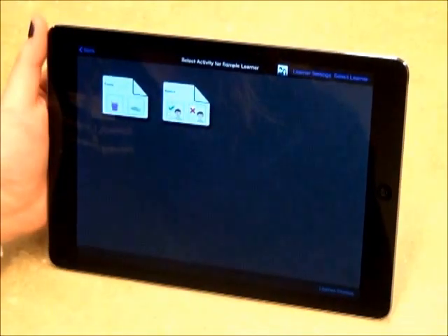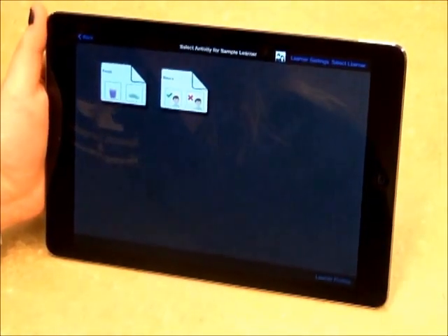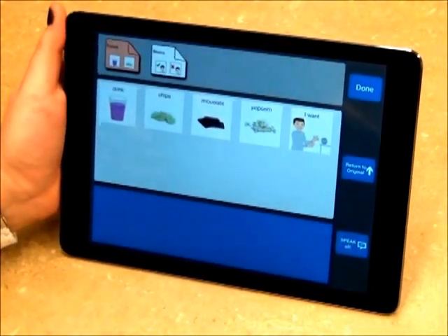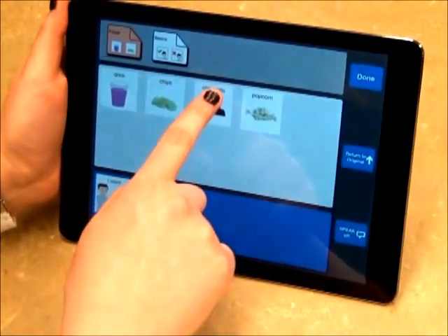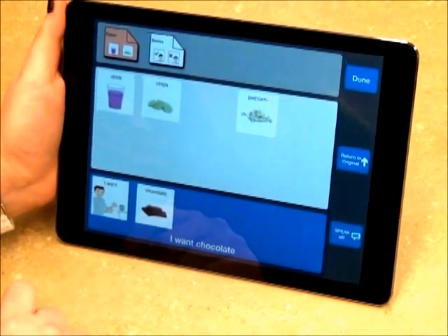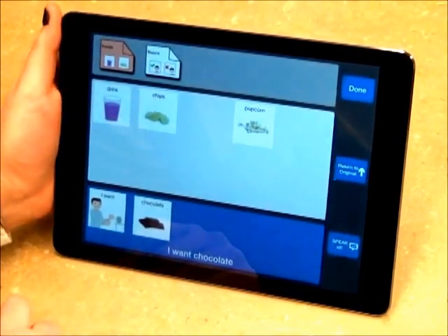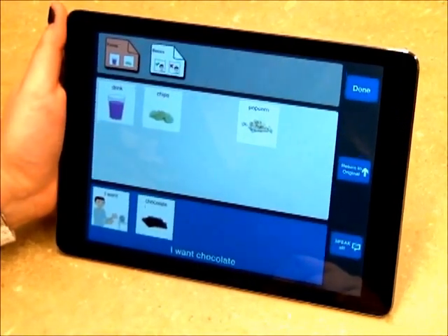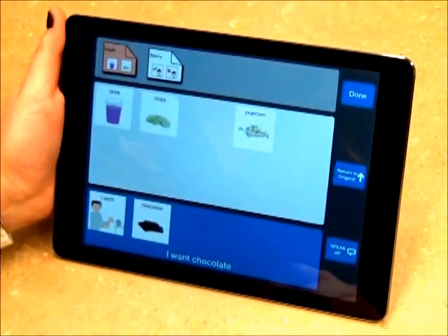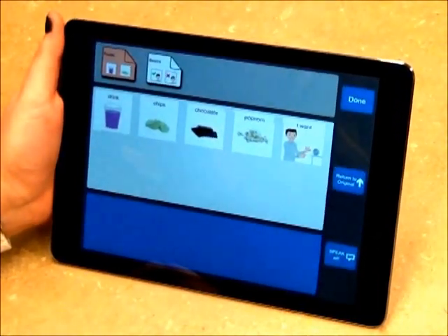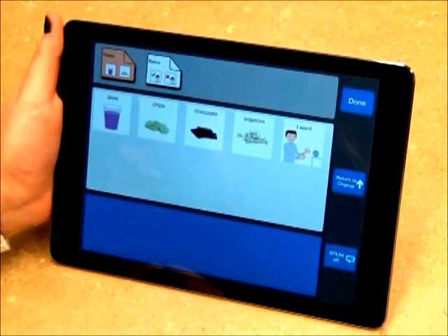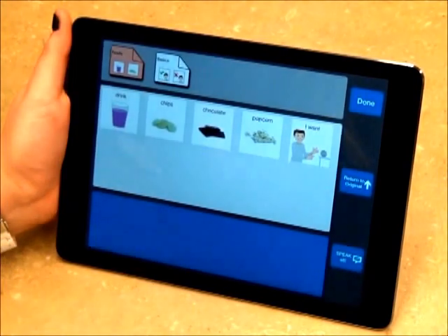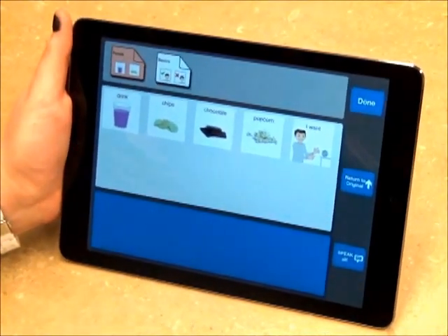Once you have configured learner settings, you are ready to enter play mode by tapping on an activity sheet. To create sentences, select a symbol from the screen — I want chocolate. Speech output will play automatically. To speak the full sentence one more time, hit the Speak All button. To start a new sentence, hit the Return button. To switch between activities, select another activity sheet at the top. Once the learner is ready to exit, select Done.